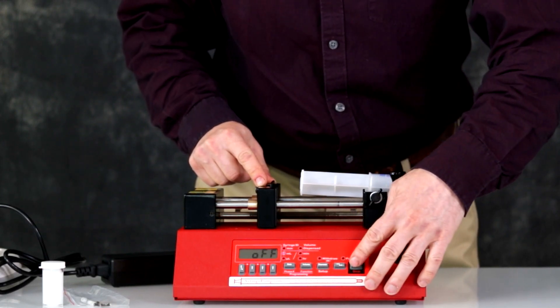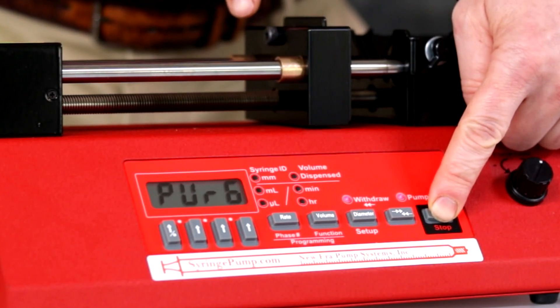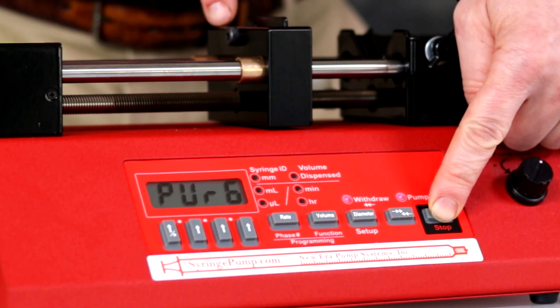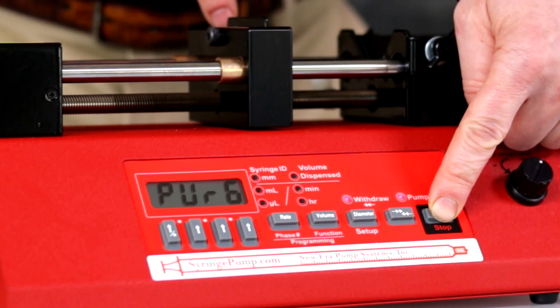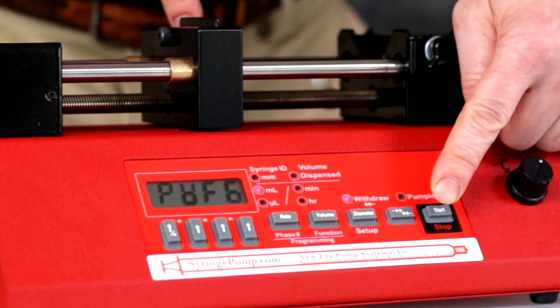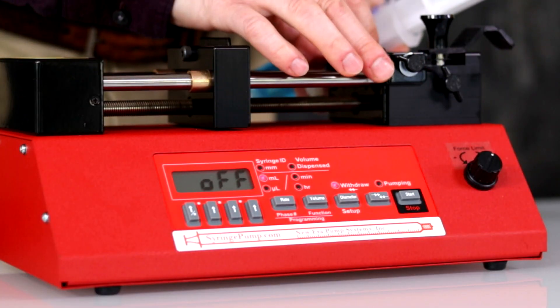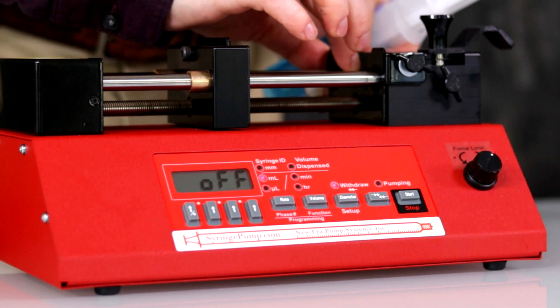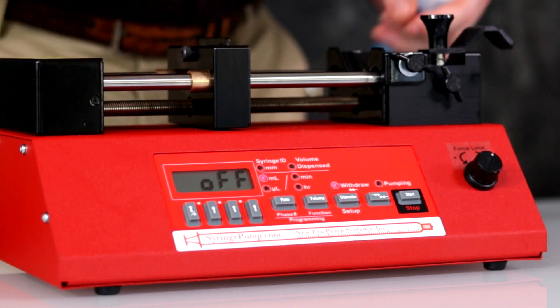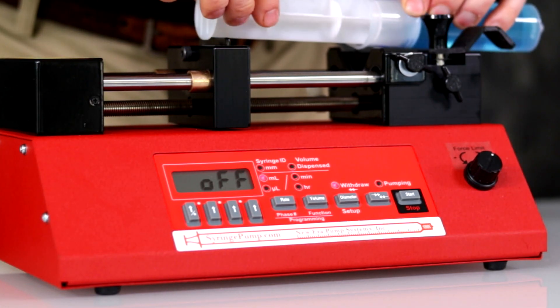Release to stop. Loosen the bracket for the flanges. This is the anti-siphon bracket. Position the flanges between the bracket and the syringe holder. Insert the syringe.